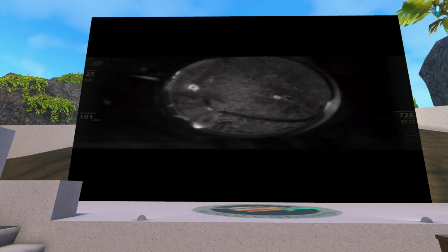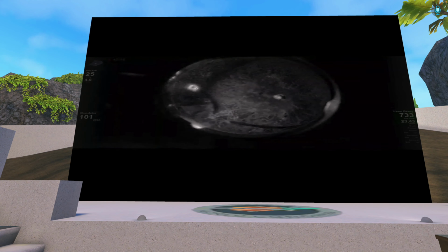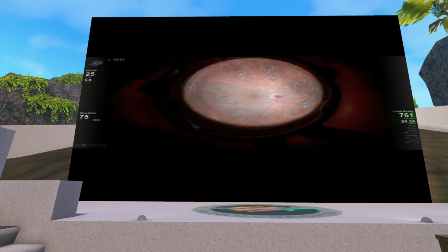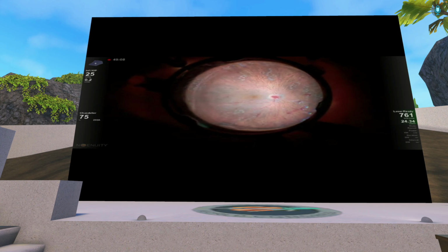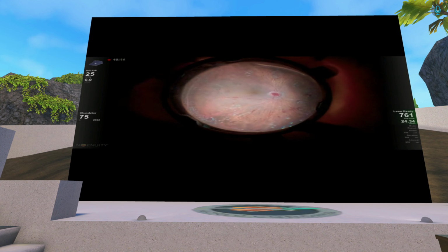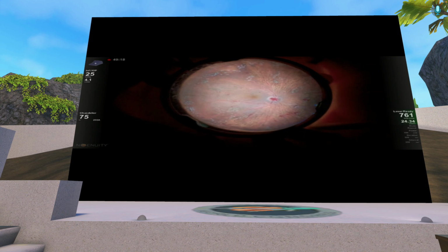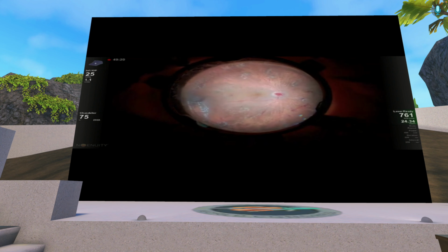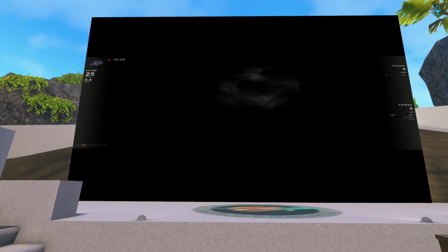This is a diabetic case, but we had another case which was peripheral occlusive vasculitis, and again it was useful because we found the diagnosis with the intraoperative fluorescein angio because there was a hemophthalmos. Now here you can appreciate how much laser is done and how much retina is actually spared from our laser. So basically these are my cases.